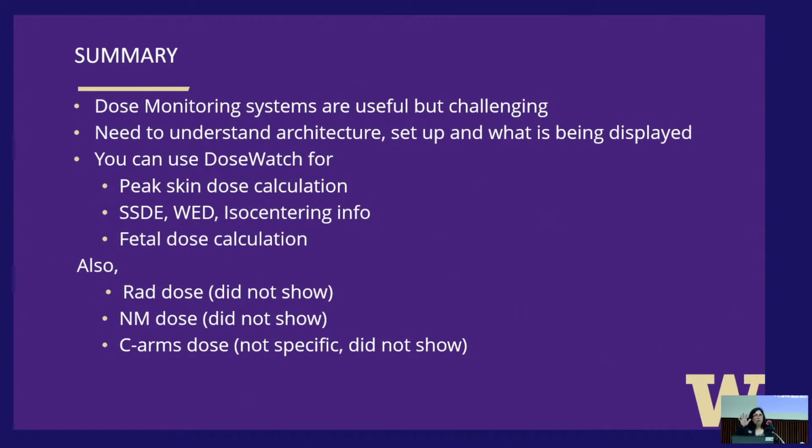So for Dosewatch, it's great. Infinite, as I said, I don't really like Infinite so much. DoseM is their program. And what they used to do is to sum all their CTDI vols. You don't do that. You don't do that. So things like that, you need to have confidence in the data that's coming out and validate that before you can say, yeah, I can blindly trust my dose monitoring system.